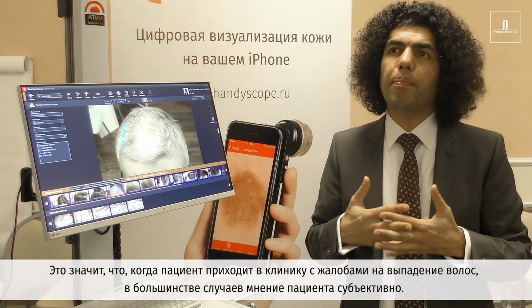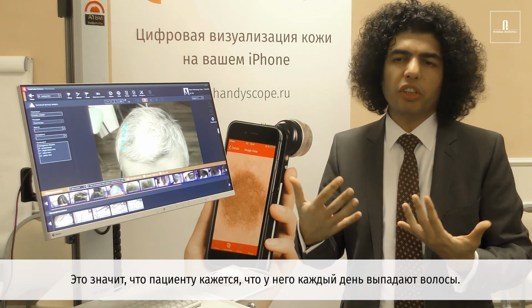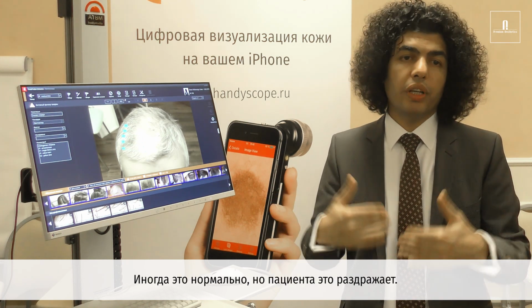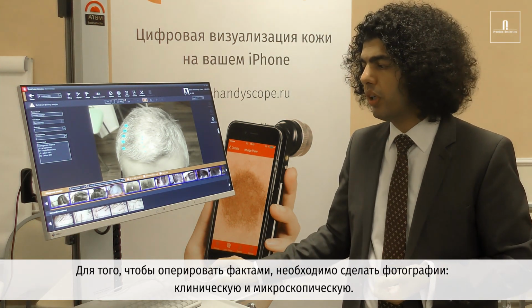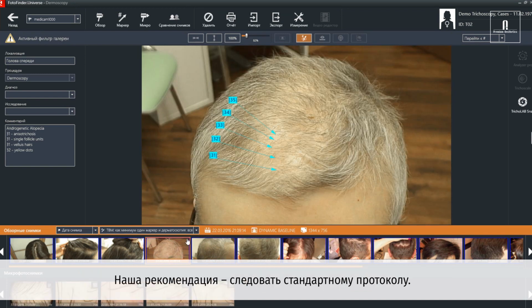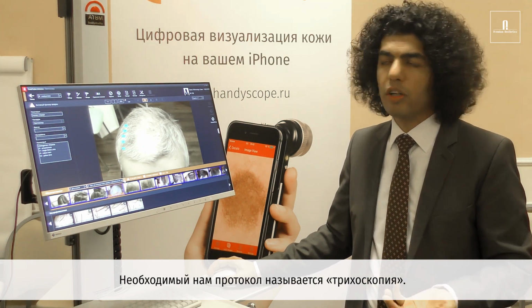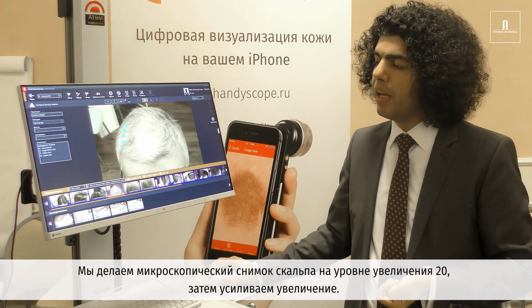In most cases, the patient has a subjective opinion. That means the patient feels that every day is losing hair. Sometimes it's quite normal, but it's annoying the patient. In order to talk about facts, you have to take photography, clinical photography and microscopic photography. Our recommendation is to follow a standardized protocol. And the protocol that we follow is called trichoscopy, developed by Lidia Rudnicka in Warsaw University in Poland.